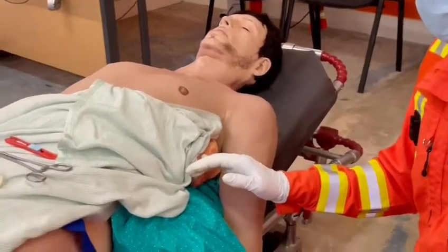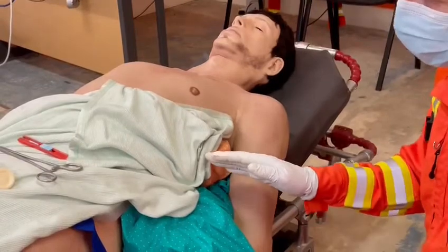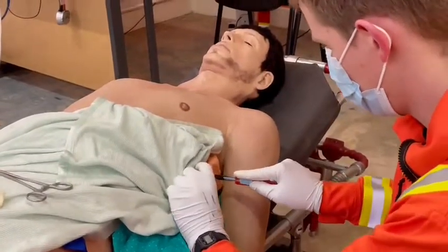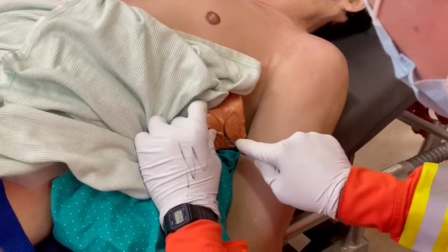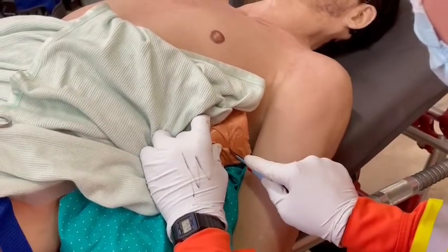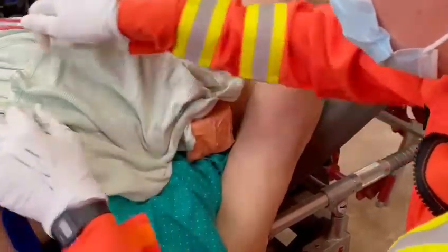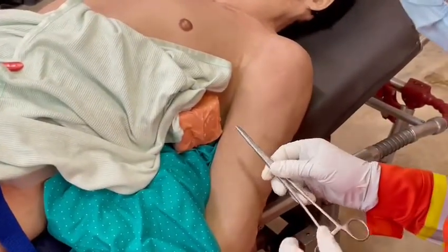With the incision, I'm looking to go just over the top of the fifth rib, because underneath the ribs run the neurovascular bundles — by going just on top of the rib I know I'm in a safe place. I'm going to get my scalpel and make a two to three centimetre incision along the top of the rib. That's quite a firm, positive incision, cutting down to the depth of the muscle layer, but not through the muscles themselves — through the skin and soft tissues into the muscles. Don't worry that it will bleed a bit; that's to be expected.